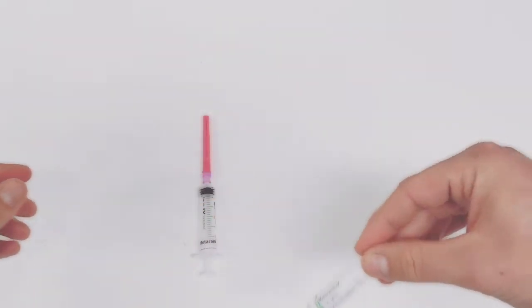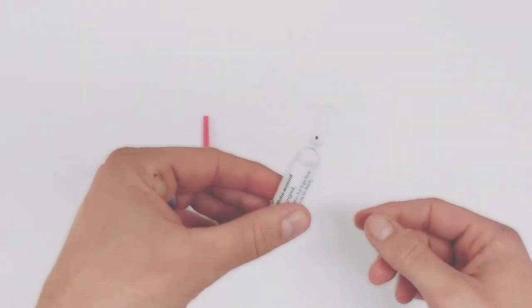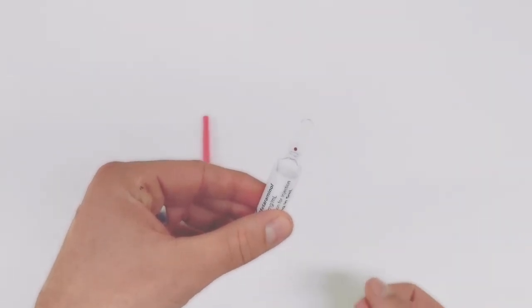I'll do that again. What you're doing is a flick round like that, but vertically. Generally that will get most of it out. It doesn't matter if there's a tiny bubble left.